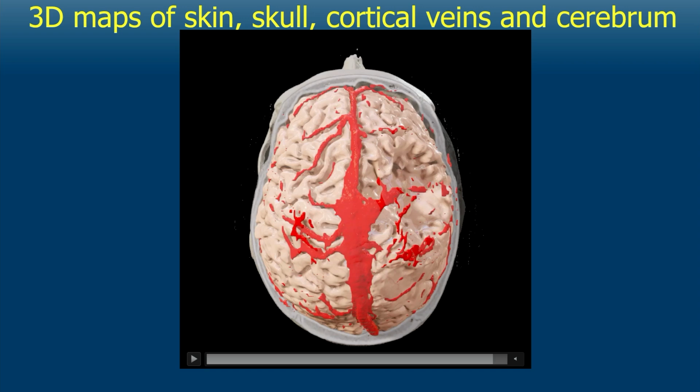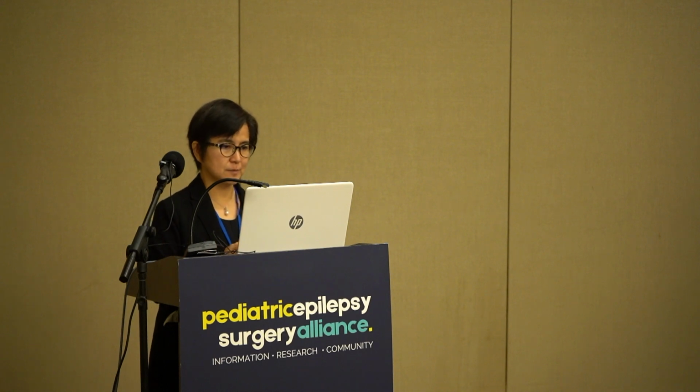This type of information is incredibly helpful for our neurosurgeons when they plan their surgery, and we can transfer all these post-processed images into the operating room space so that they can use it as a GPS or as a roadmap when they do their surgery.